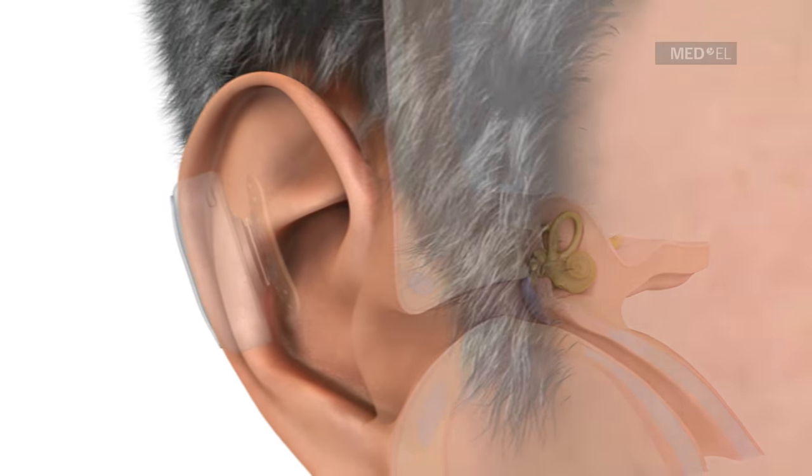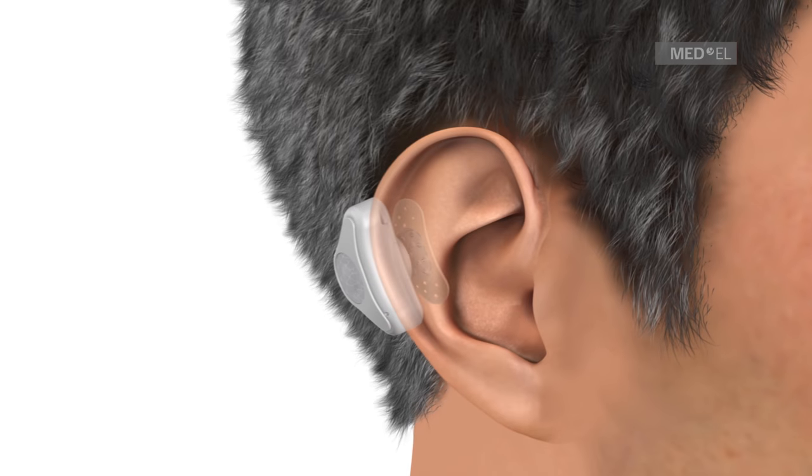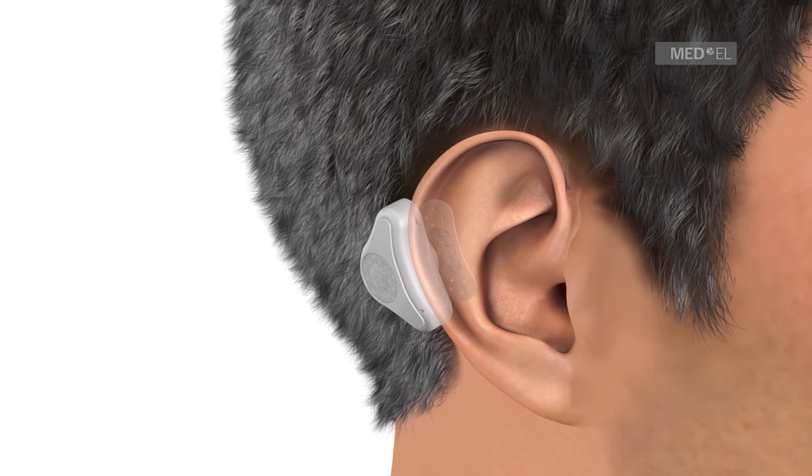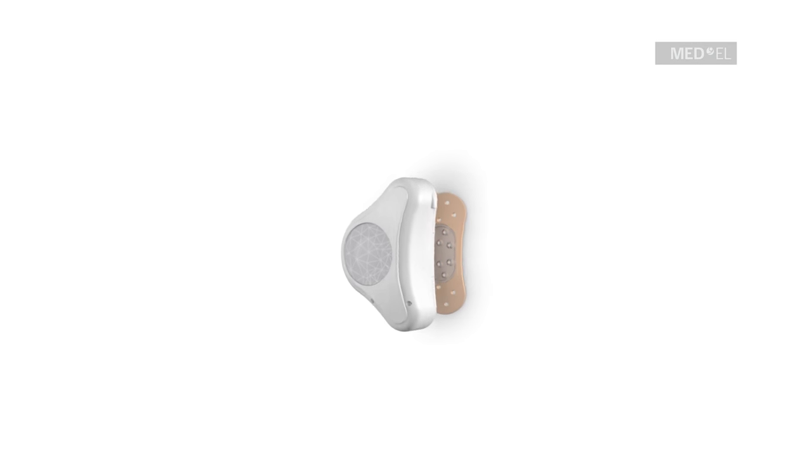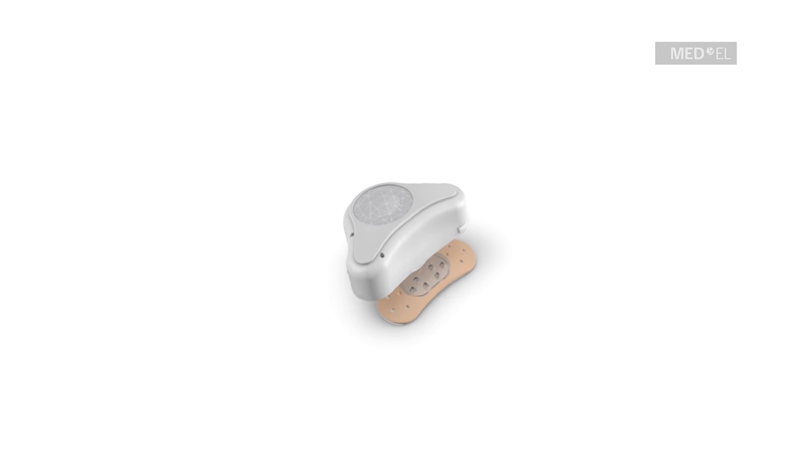The system has excellent cosmetic appeal and can be worn discreetly behind the ear. With this unique concept, Adhere provides a viable solution offering a life full of sound.